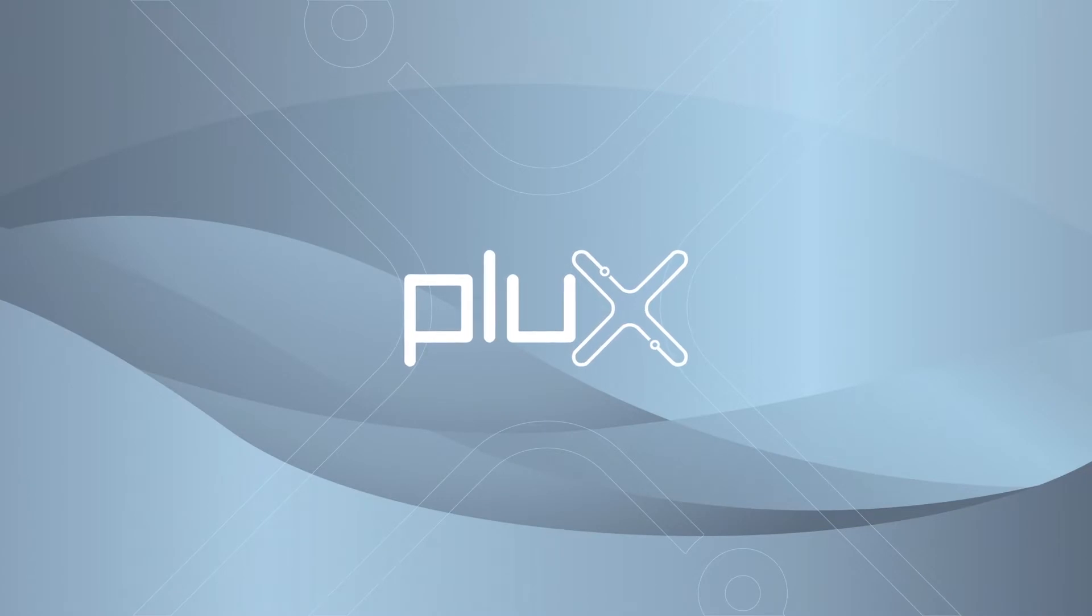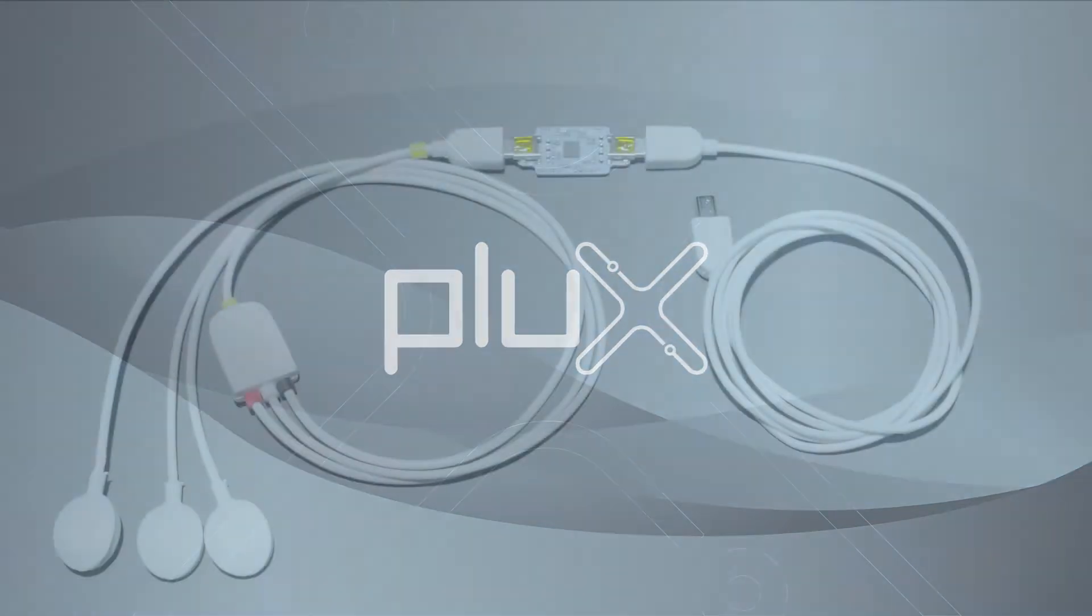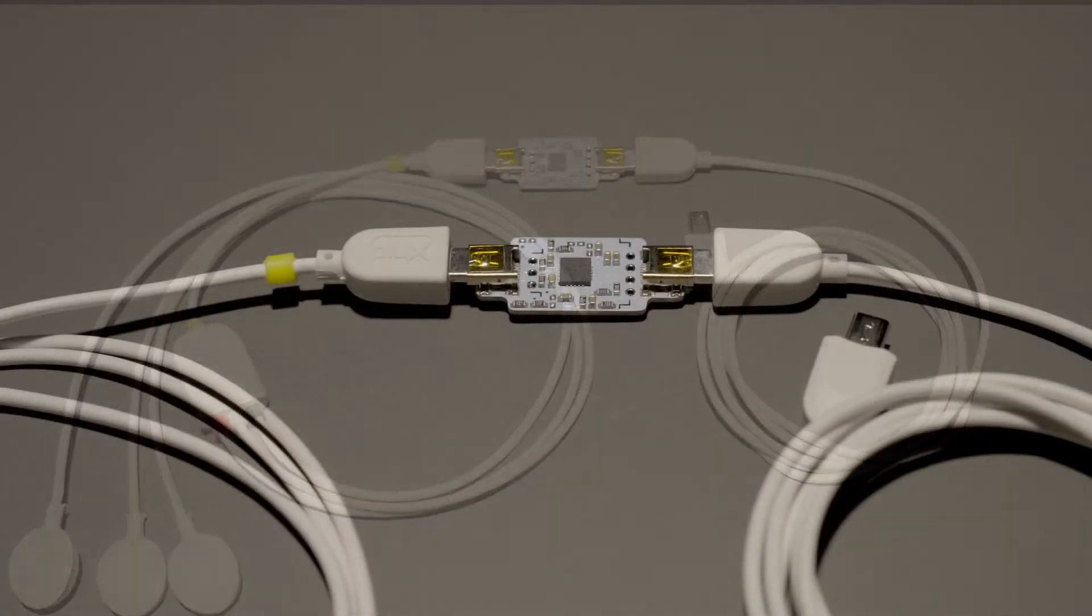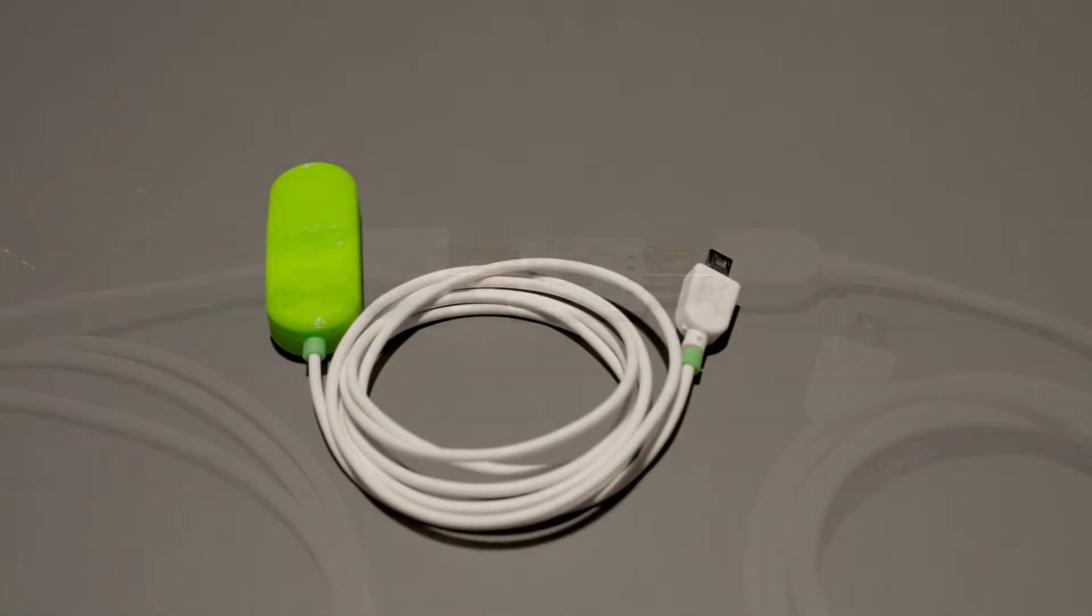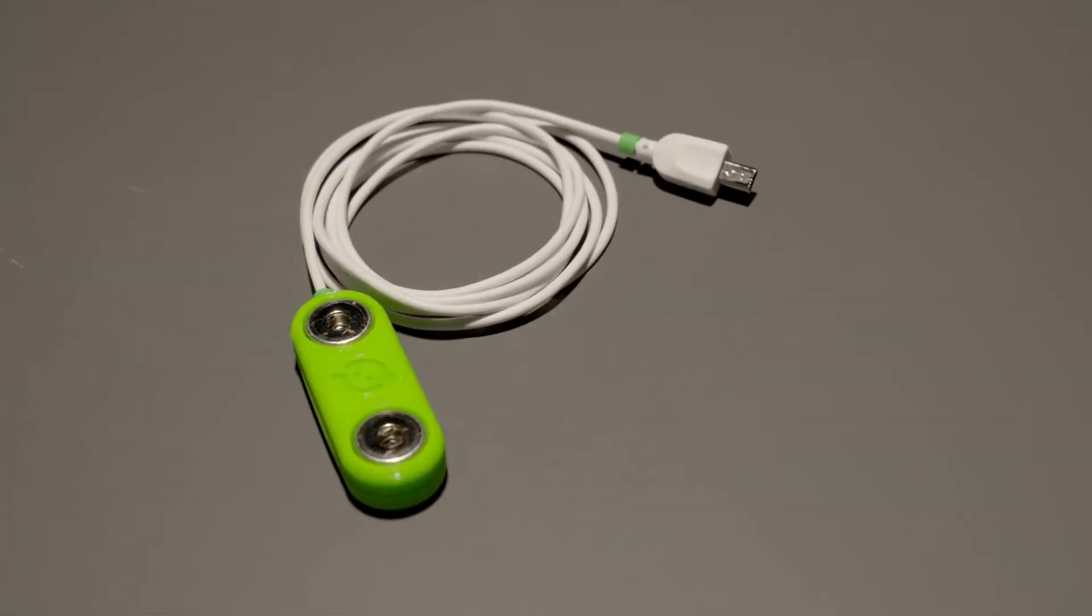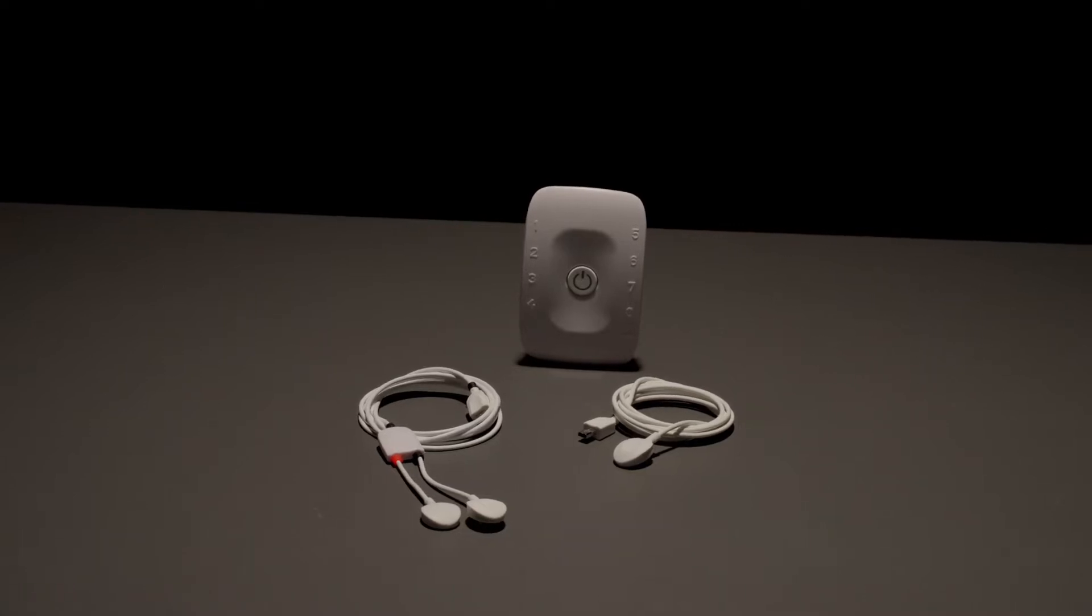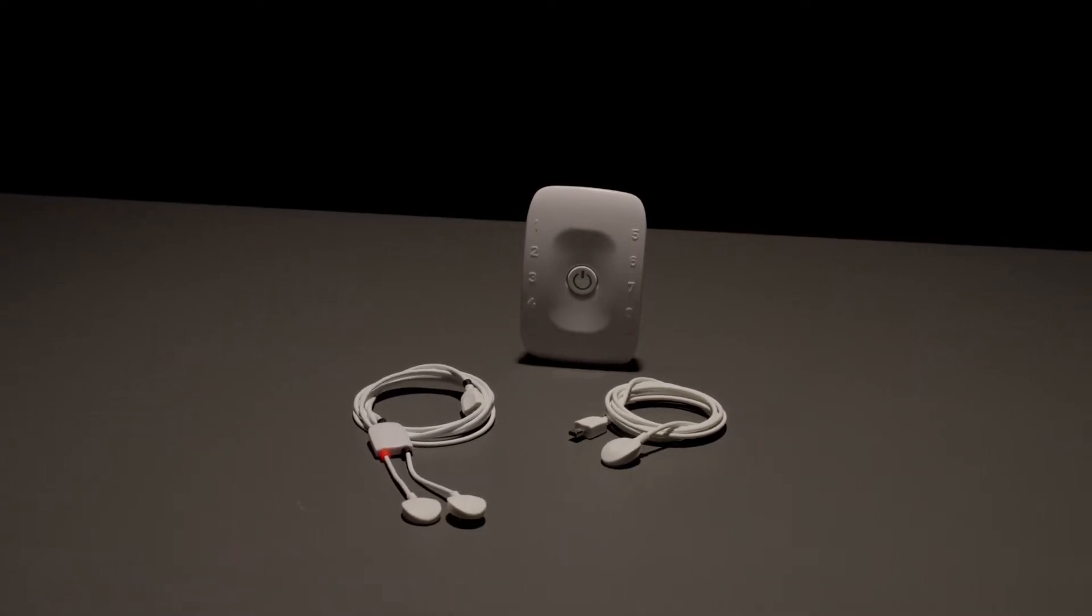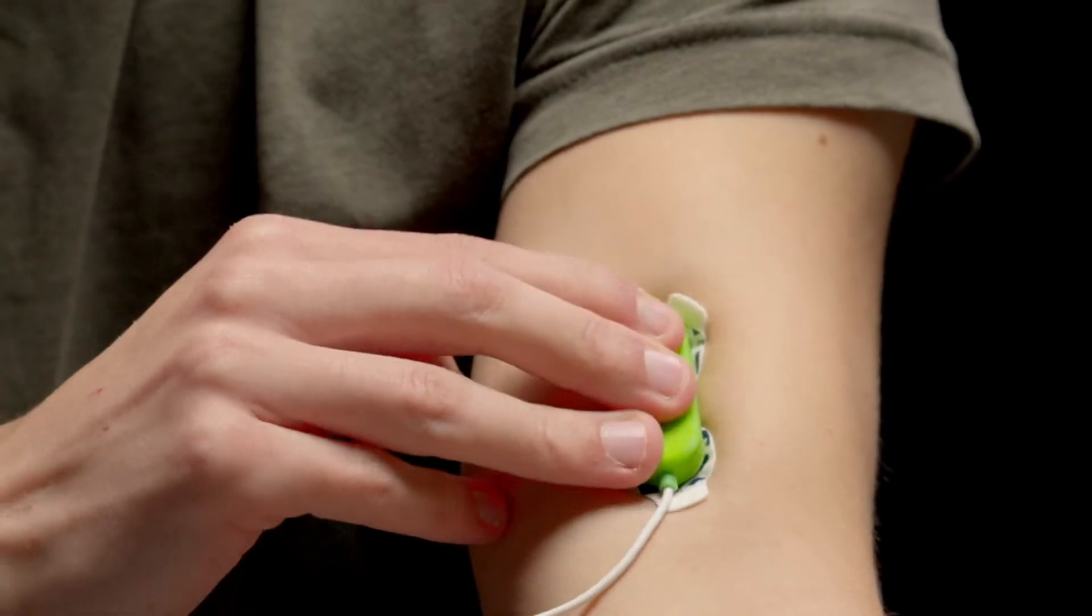How do we place the EMG electrodes? Today we are going to show you the differences between the Bitalino EMG sensor cable options and the Biosignal PLUX sensor and, most important, how to place the EMG electrodes.